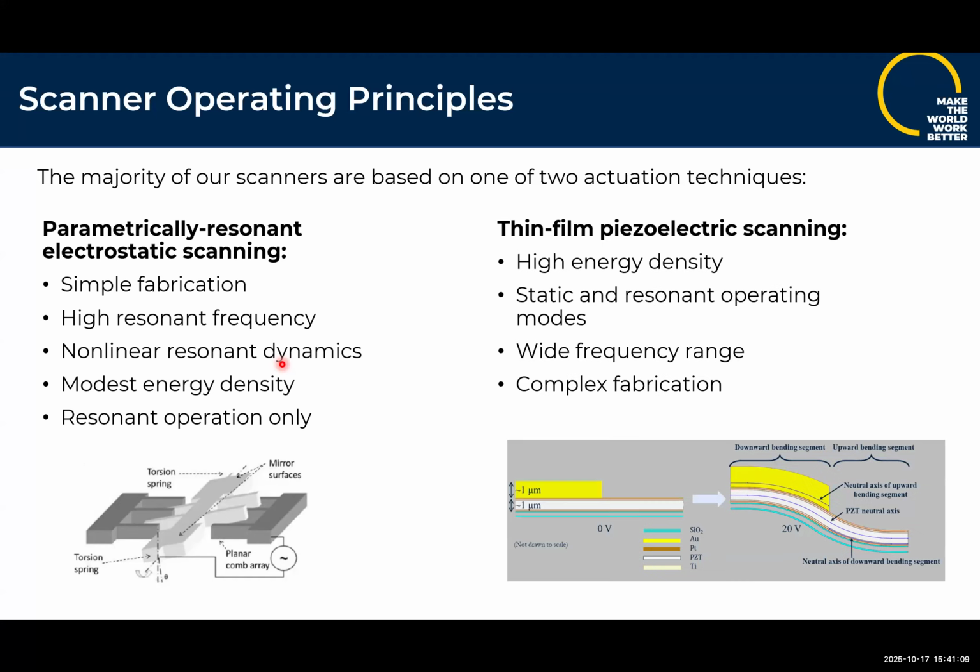laser light. The other types of systems we work a lot with are thin film piezoelectric actuators. So piezoelectric devices, if you're familiar with the macro scale, you apply a voltage across them and they contract or expand. At the micro scale, there are thin films, a micron thick, across a wafer. They contract and they naturally produce bending motions because they are contracting relative to the neutral axis of other layers in the structure.